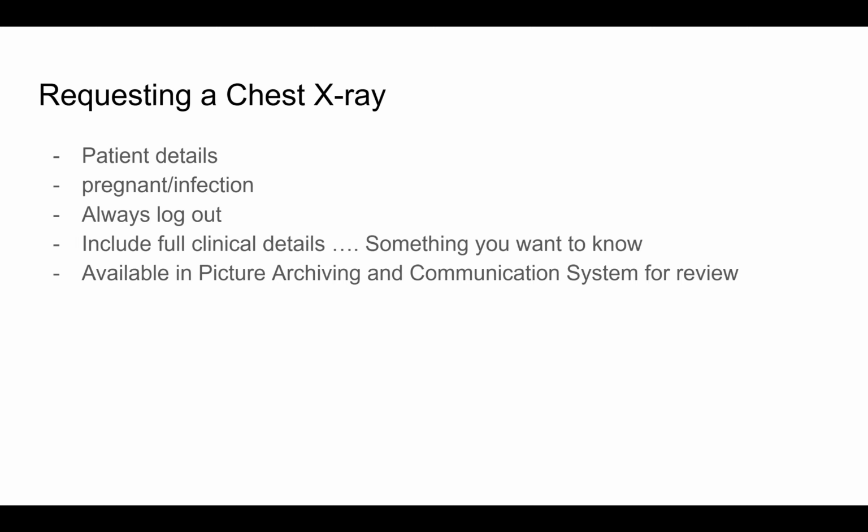So when requesting a chest x-ray, we should know certain things. One is the patient details. We should always double check them: the name of the patient, the age, and the gender of the patient. We should always know if the patient is pregnant or at risk of any infection. Because of legal implications, we should always log out after making a request and not allow anyone else to work on your EMR while making a request.